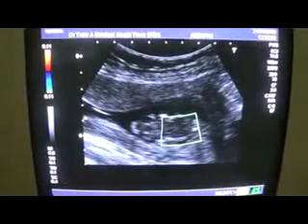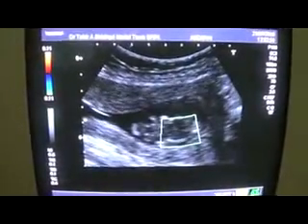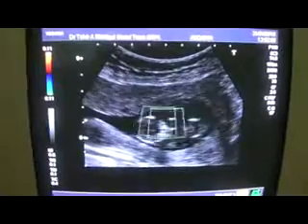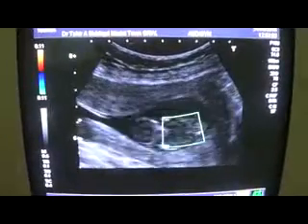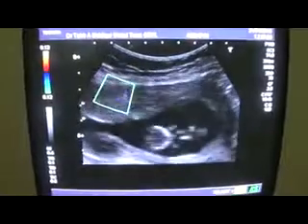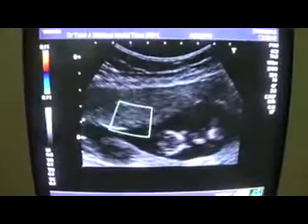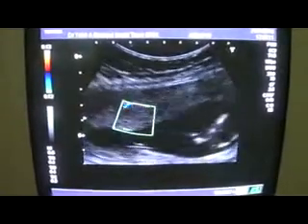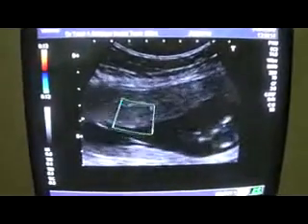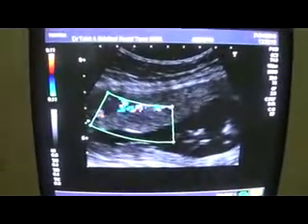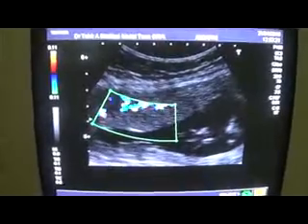Again, we do not see any cardiac flicker in fetus number two. This is the head. This is the body. This is the placental development, and the placenta starts developing already at 10 weeks gestational age. This is the placenta.